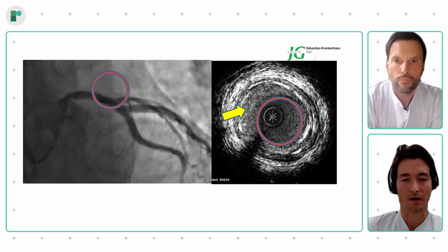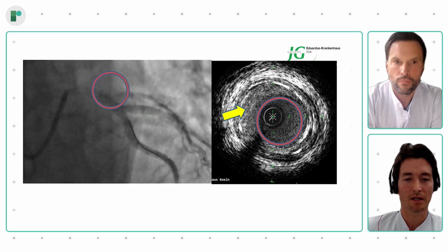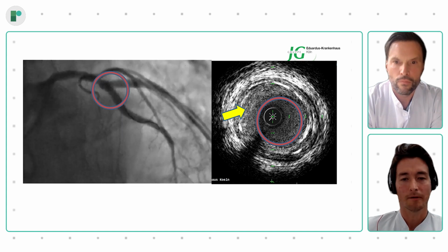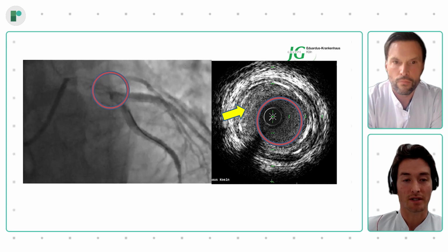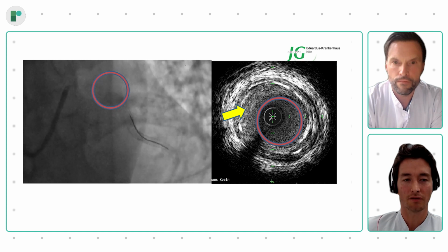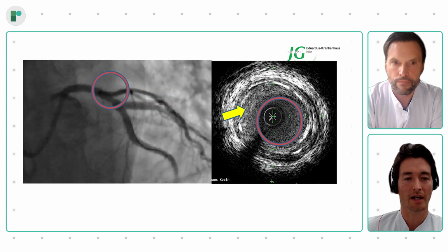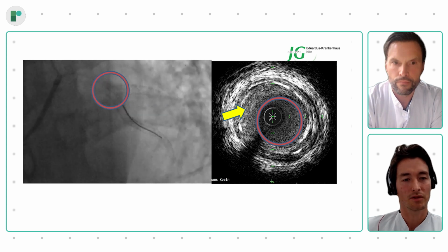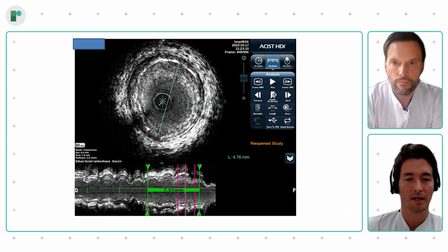Should we perform iFR? Due to the location of the stenosis and the intermediate degree, we straightforwardly decided to treat this lesion. But based on the angiography, can we confidently treat this lesion? Because there is a very large diagonal branch really shortly after the location of the stenosis.